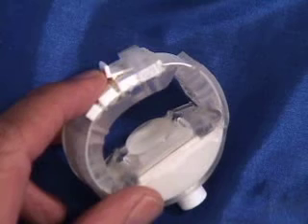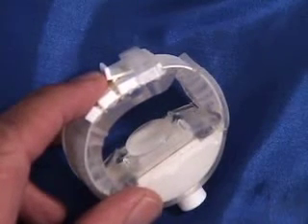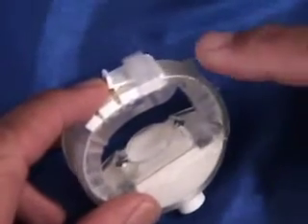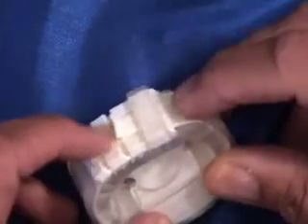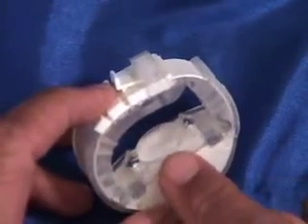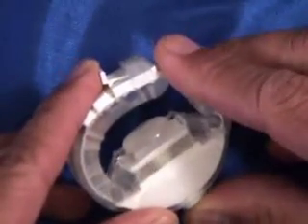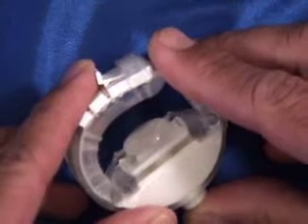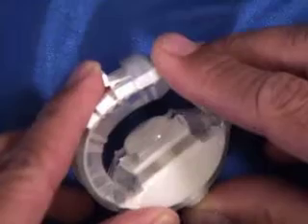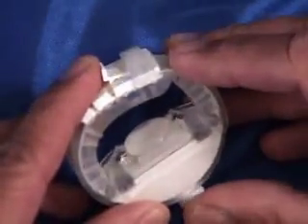It is necessary for patients to become familiar with the different components of the device. The different components of the device are a strap, which is made of plastic, soft lining, elevation in the soft lining, and a button that is used to push this elevation in the soft lining up to compress the urethra. When this button is pushed again, it depresses the elevation to release the pressure from the urethra.